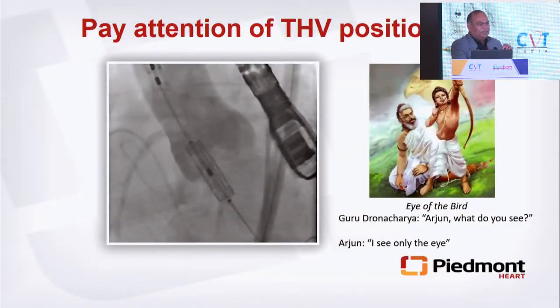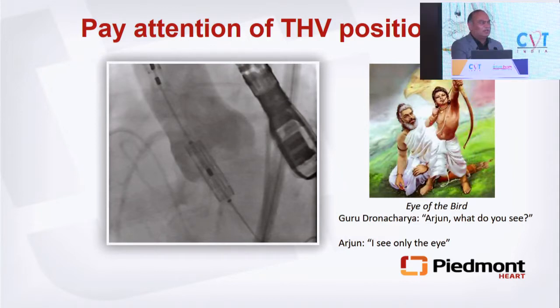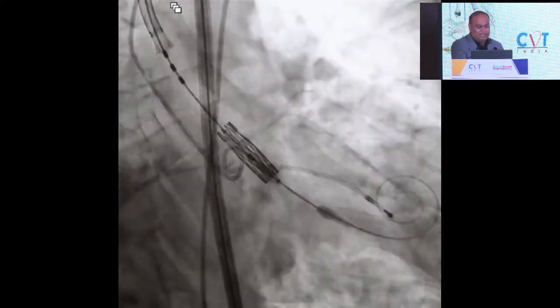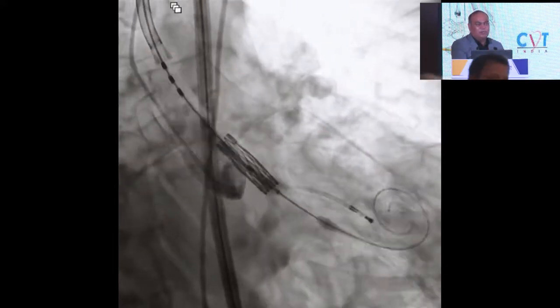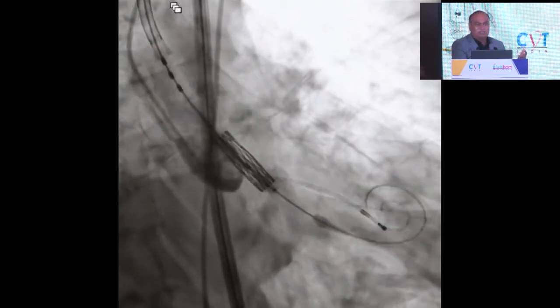So basically, pay attention to the THV position right in the center marker. Those are the most important 15, 20 seconds of a Sapien case. Just like Arjun saw just the eye of the bird, you should be looking just at the marker in your cusp or in your coplanar view. This is a very similar example. Notice the ventricular marker of the balloon is not very nicely aligned to the stent frame. 1 or 2 millimeter offset, right?